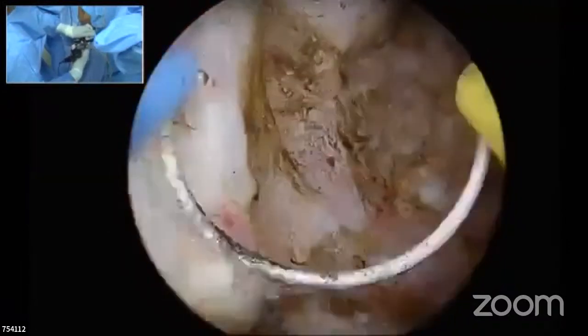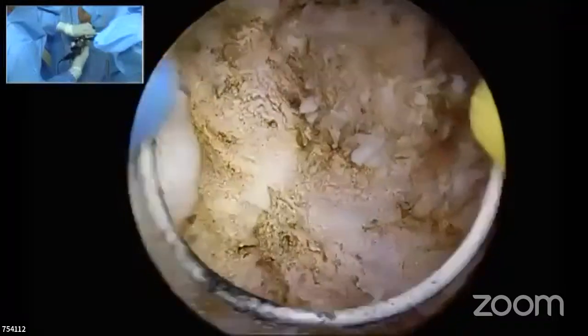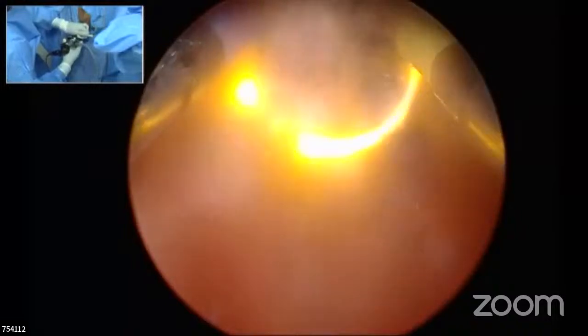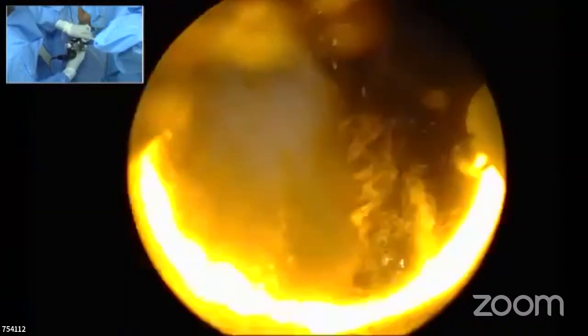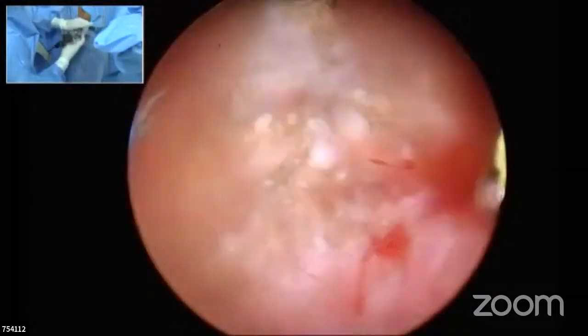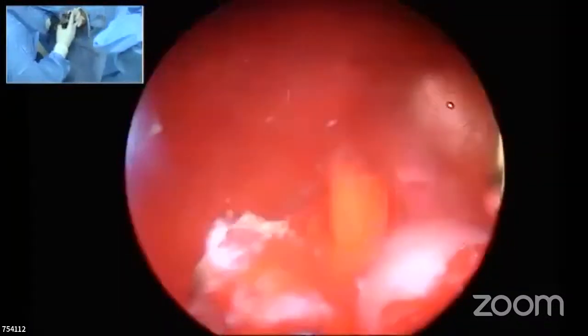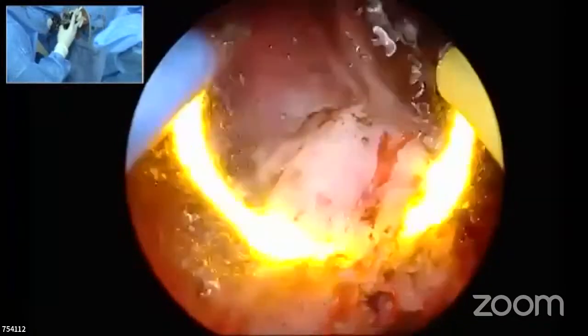So this is what I always say. It doesn't matter, people don't use the loop completely. Using the loop completely may have more problems because you don't have control of the loop and the depth at which it was. What's your take on that, sir? Half loop resection.